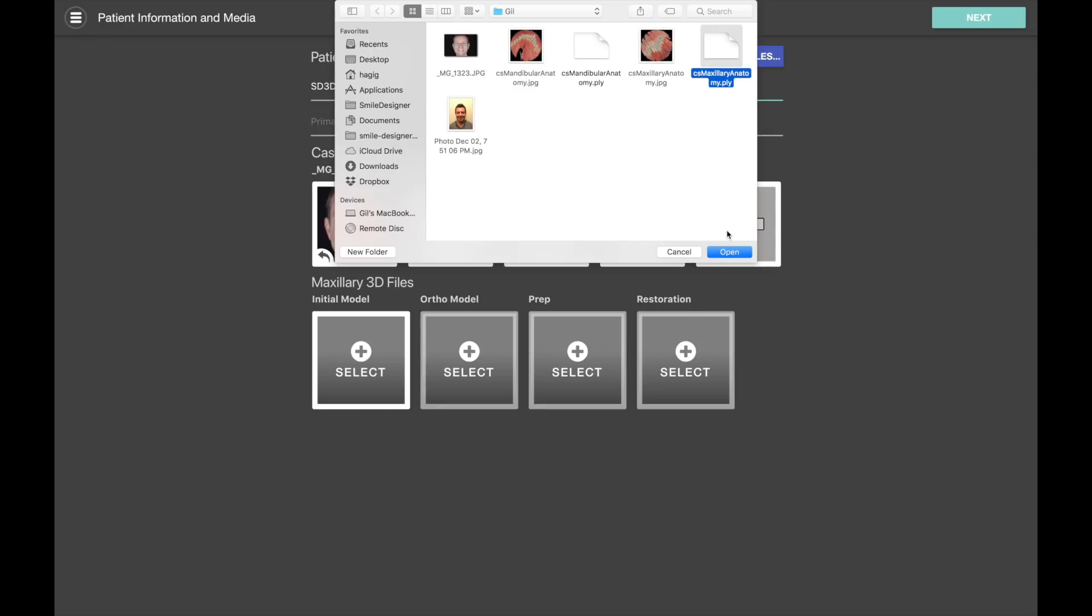Smile Designer Pro supports PLY files, STL files, and some OBJs. We're working on expanding support for more and more scanners, so if you try this feature with your scanner and it doesn't go as you expect, please get in touch with us and we'll add support to your scanner as well.